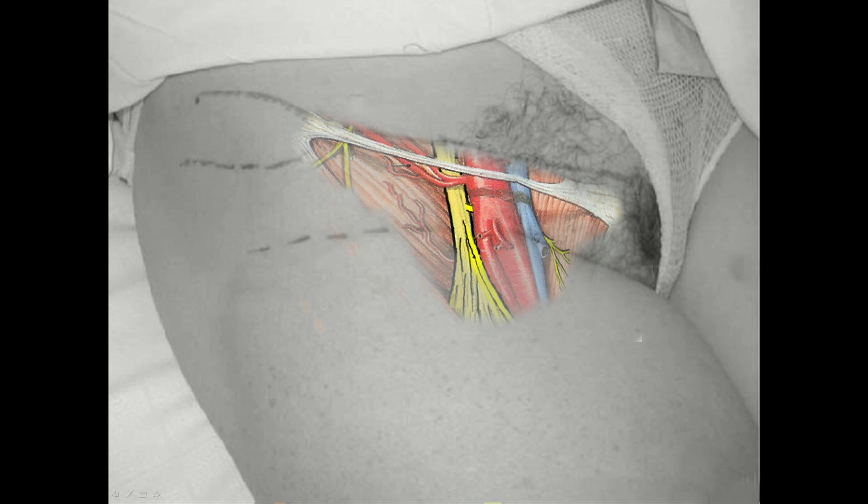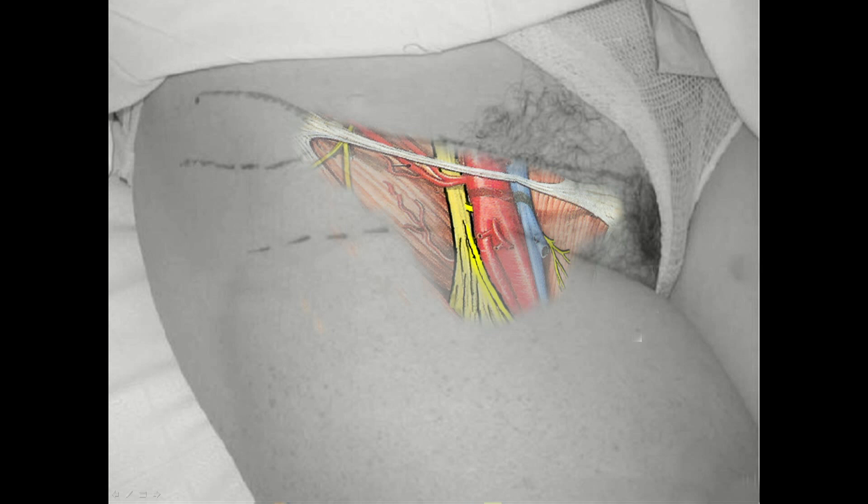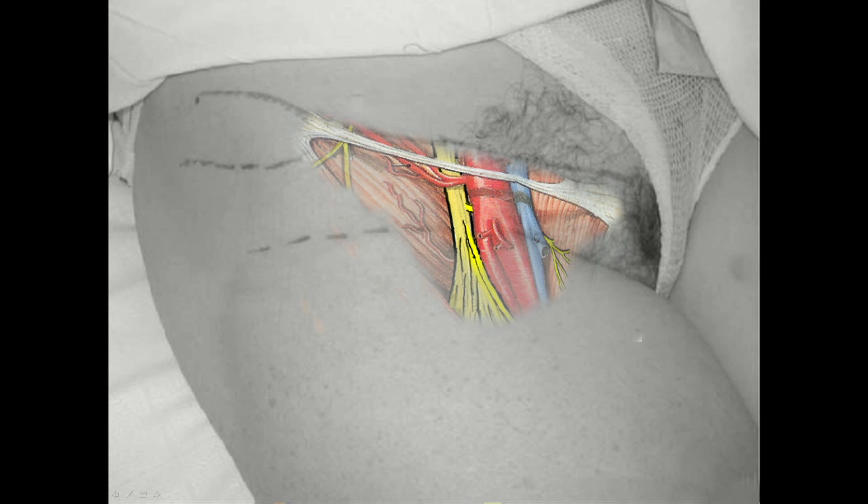The groin crease has no relationship to the inguinal ligament. In young thin individuals the groin crease will be 2 cm distal to the inguinal ligament, and in older flabby individuals the groin crease can be 20 cm distal to the inguinal ligament. Therefore, do not use the groin crease as a universal landmark reference to determine any point to do a femoral nerve block.